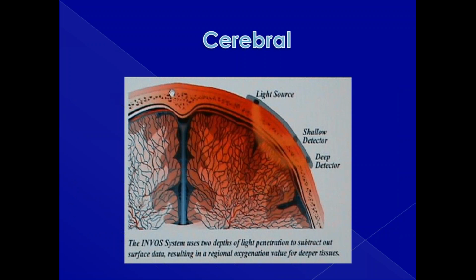Okay, so this shows here there is our scalp electrode here, and the photons are transmitted nearly 2 to 3 centimeters into the tissue underneath the skull.